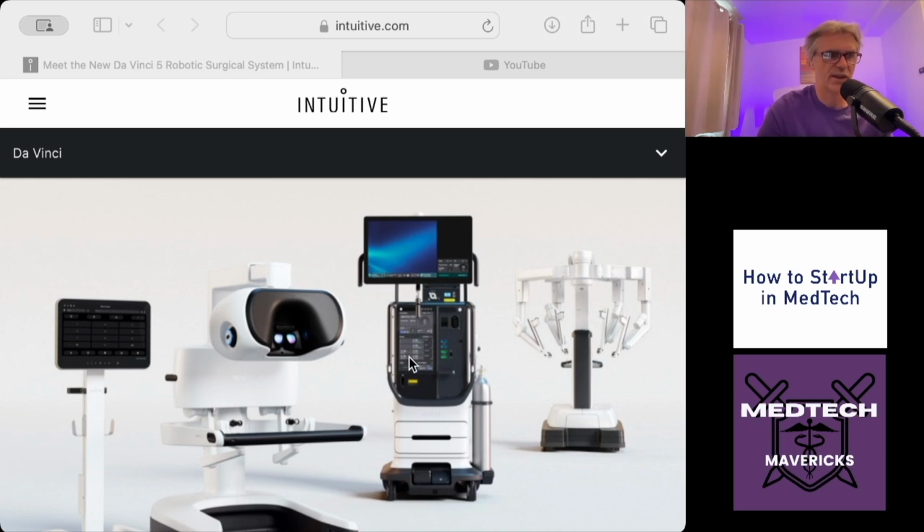And when I say the energy system, I got told off the other day because I was talking energy systems and people didn't understand what I was on about. What that actually is, it's electrosurgery, diathermy, bovie, whatever you want to call it. But this is delivering simple monopolar and bipolar and advanced energy systems. And what's interesting is I noticed when I was there that there are presets for things like hernia or for colorectal. So it automatically finds some of the best presets. So it's got a little bit of smarts in there as well.